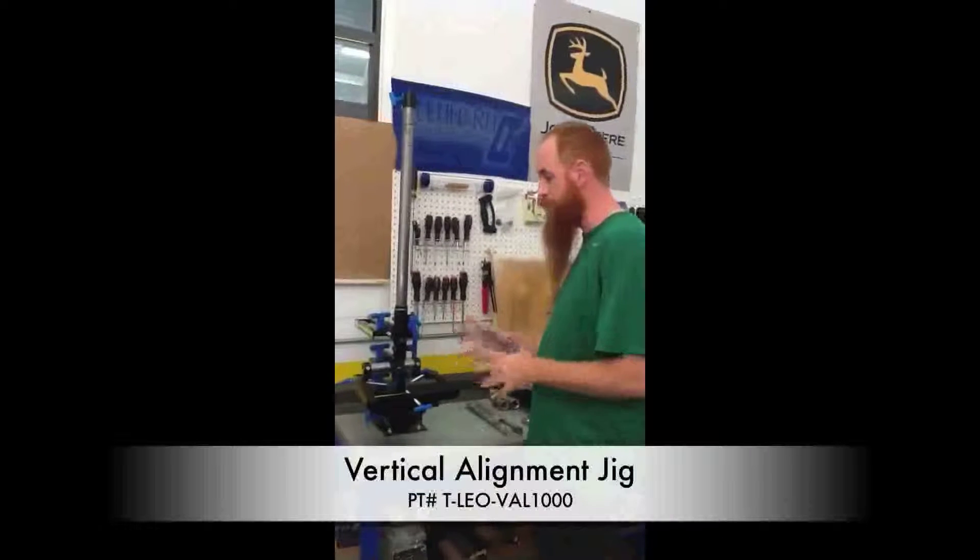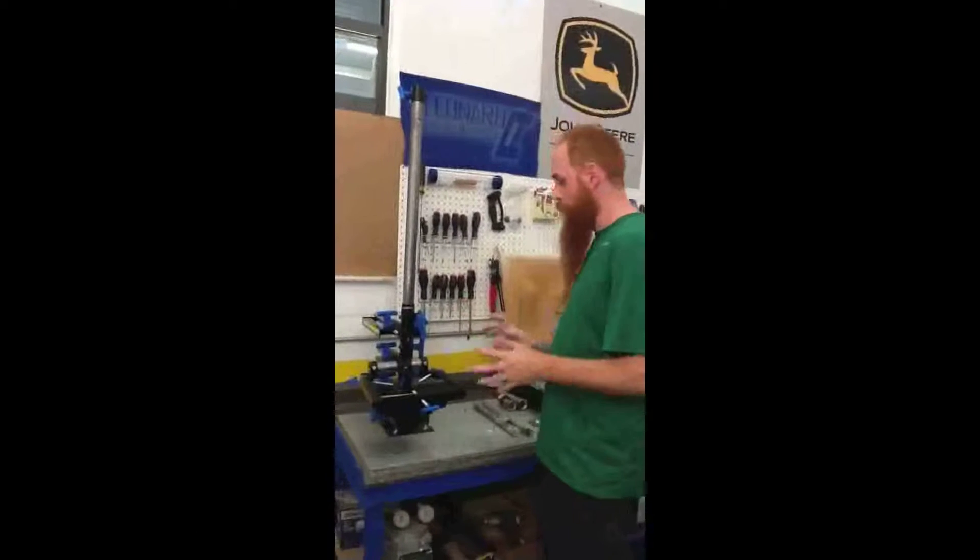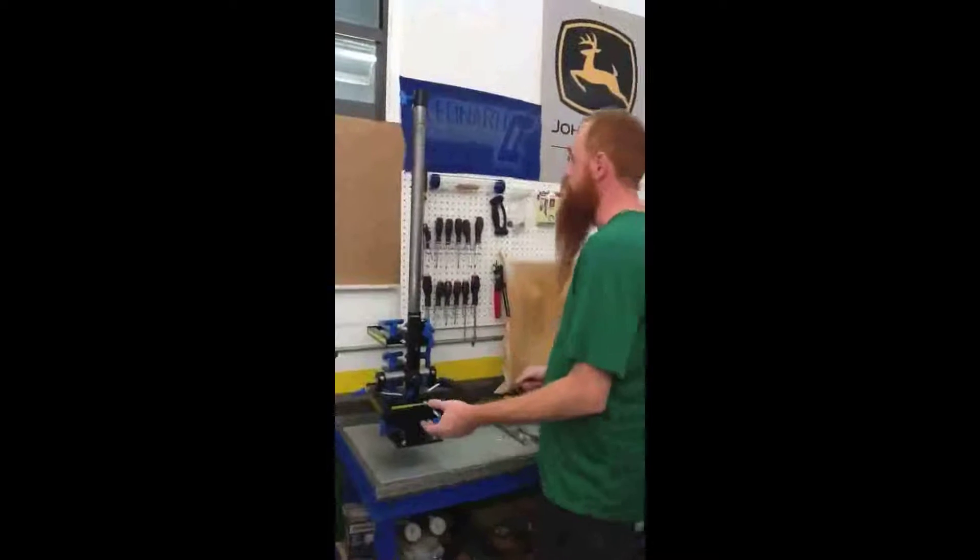This is for aligning prosthetics and transferring prosthetic alignment. We'll go over some general features first.